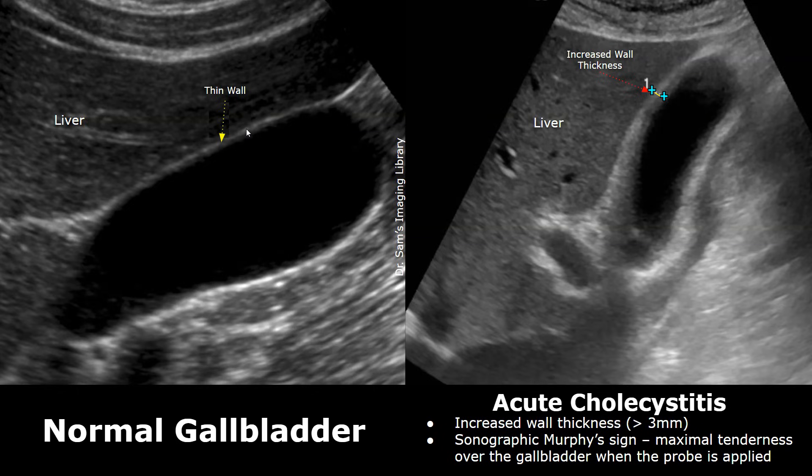Sonographic Murphy sign refers to the tenderness in the gallbladder region. The patient feels pain when the probe pressure is applied at the region of the gallbladder. This tenderness indicates acute cholecystitis.